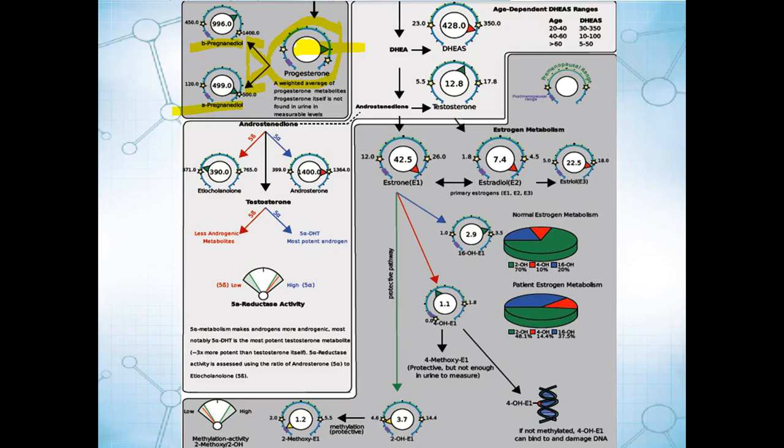As you look at the estrogen, we showed on the summary page the total, but here you can see a more detailed breakdown of E1, E2. So this is your most potent, your parent hormone that your ovaries make, and then you've got all these different metabolites. When we talk about phase 1 metabolism, that's looking at which of these 3 pathways is preferred in terms of metabolism. So you can look at those. You can also look at those as ratios.